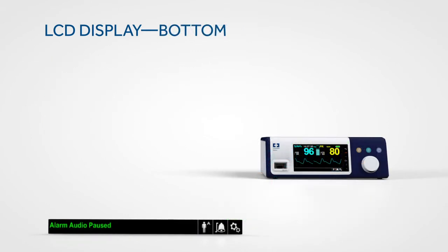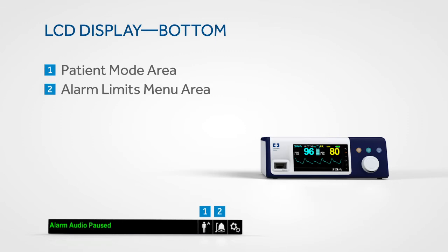The main view includes a blip bar display that indicates pulse beat and the relative pulse amplitude. A bar along the bottom of the display provides informative messages and indicators for the patient mode area, the alarm limits menu, and the options menu.